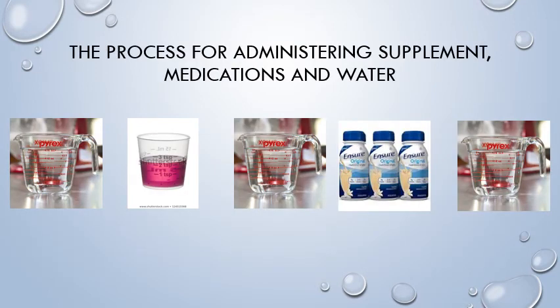When administering supplement through a feeding port, always follow the delegating nurse's instructions and your agency's standard policies. When administering enteral nutrition, direct infusion of liquid nutrition into the stomach or small intestine, never administer formula through tubes or access ports other than the enteral feeding tube or port. You must make certain to correctly identify the feeding port.